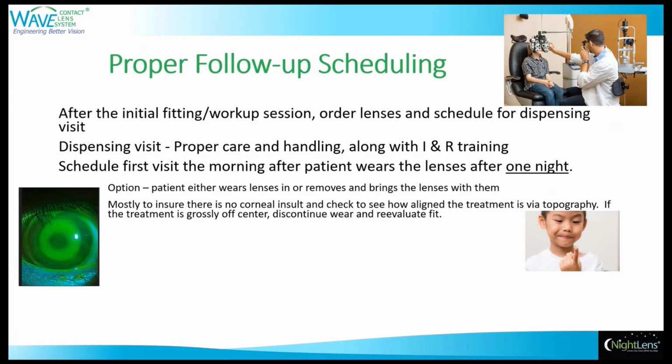Now, first morning follow-up is mostly to make sure there's no corneal insult and to check to see how aligned the treatment is with topography. If the treatment is started grossly off center, then you're going to discontinue the wear and reevaluate the fit.